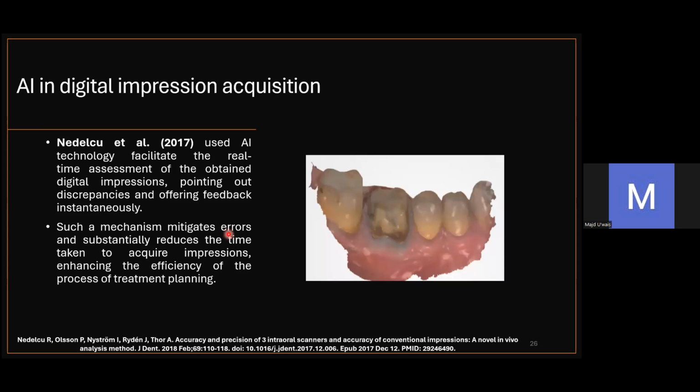Second application, the digital impression acquisition. Nidelko and his colleagues in 2017 used artificial intelligence technology to facilitate the real-time assessment of the obtained digital impressions, pointing out the discrepancies and offering feedback at the same time.